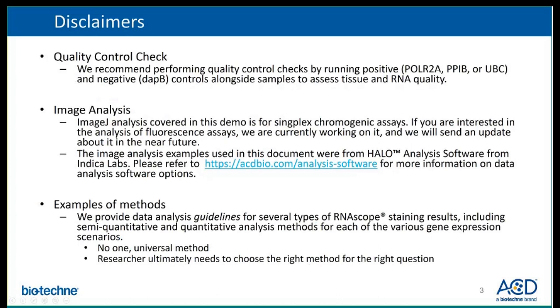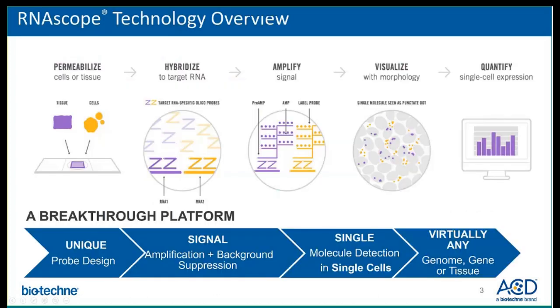Here's some disclaimers. I would like to emphasize that this demo is for single-plex chromogenic assays. If you're interested in fluorescence assays, we're currently working on that, and we'll give you an update about it in the near future. So let's get started with the first part, which is an overview about our assay. It's a quick refresher for people who already know that.